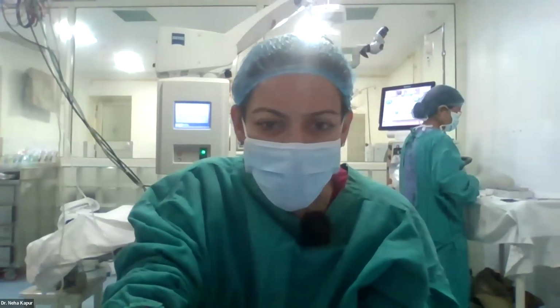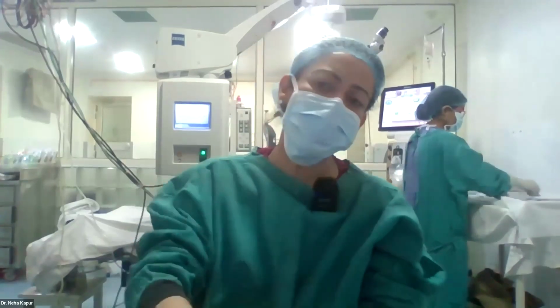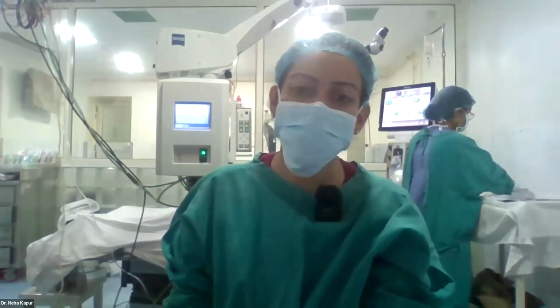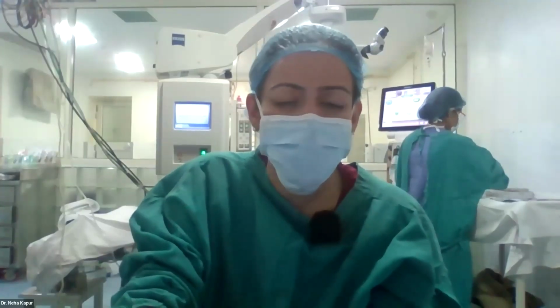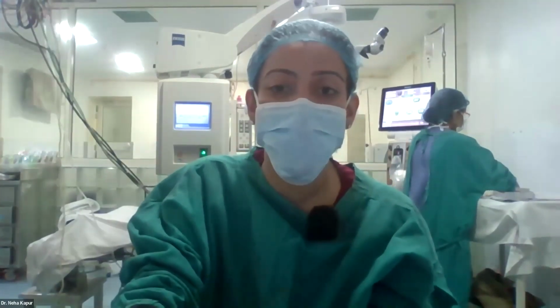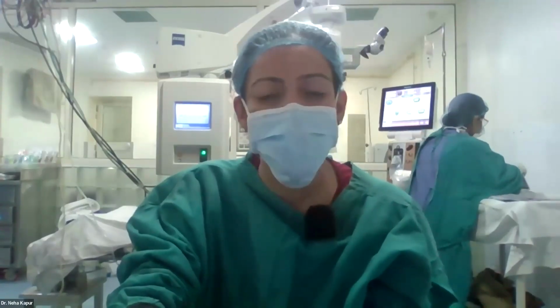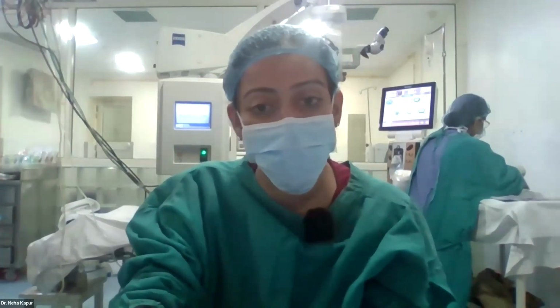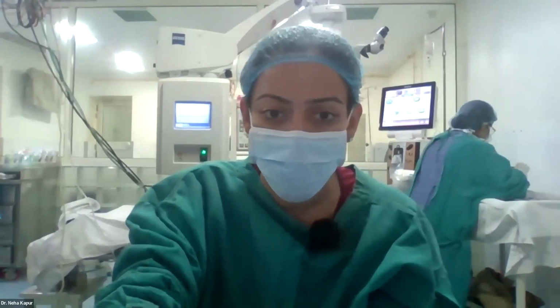Is there blood in the eye? If there is blood in the eye, how is it removed? So you can just remove it with hydro. And if it clots, if it's just a little blood, usually try to avoid allowing any blood to go in the eye in the first place. If it is there, you can just let it clot, pick it out, either wash it with hydro, or once it clots, pick it off with a McPherson and get it out.